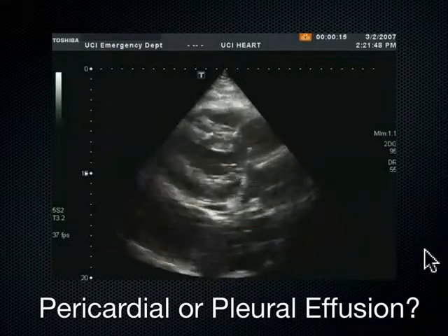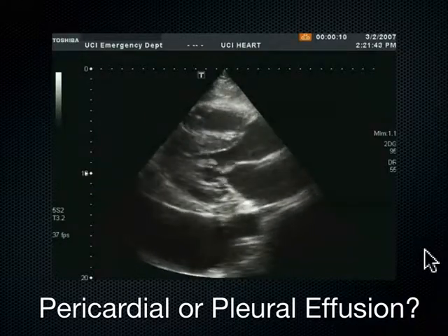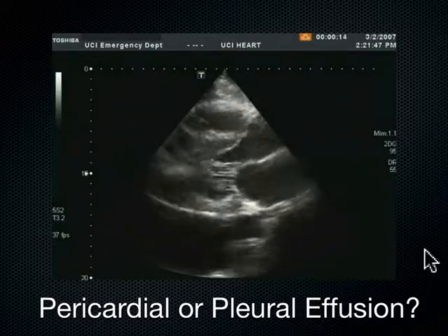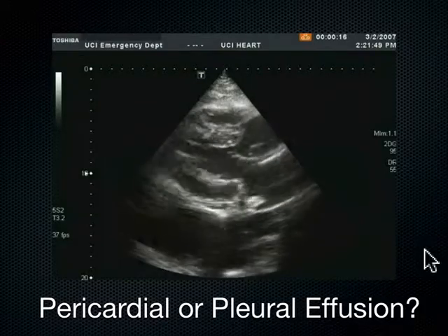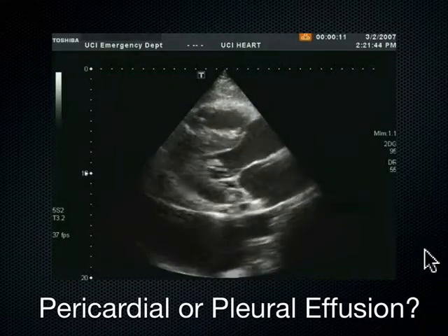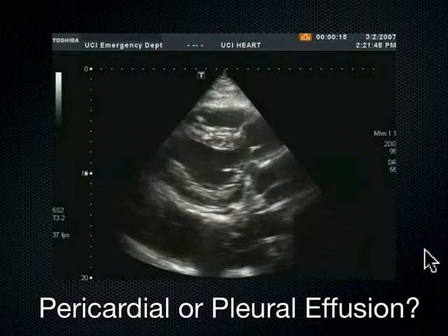Simple. I go into my FAST exam window, looking at the spleen and the diaphragm. I look superior to the diaphragm. If I don't see the mirror image artifact of the spleen up in the chest, if I see all this black stuff on top of the diaphragm, looking coronally, laterally with the P21 probe, then I know, with the same probe I'm using for this, I know that confirms to me that this is pleural.